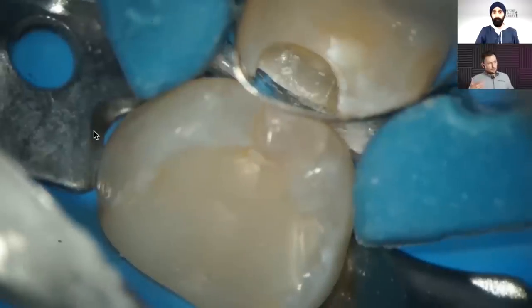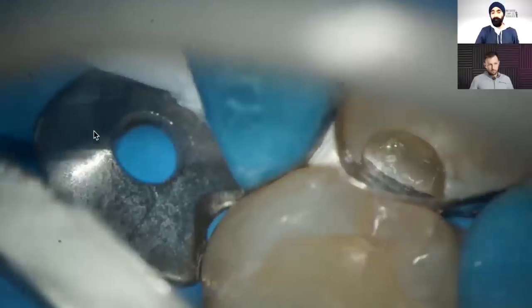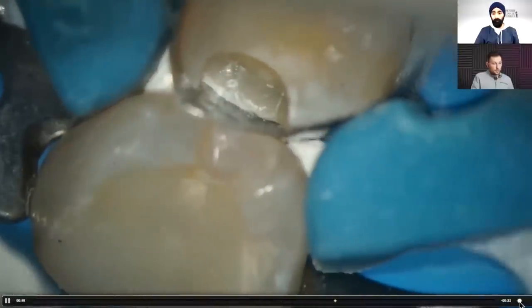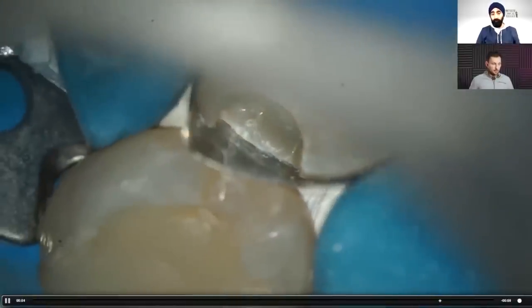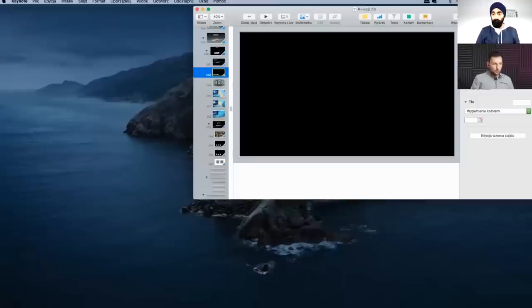With two teflon flosses simultaneously, you adapt the matrix from both sides — pulling one buccally and one palatally at the same time. On the film I was pulling from one side then the other for demonstration purposes, but in actual practice you should pull both simultaneously. Sometimes when you adapt the matrix very well cervically, you can lose the contact point — do you need a different matrix, or can you improve it?